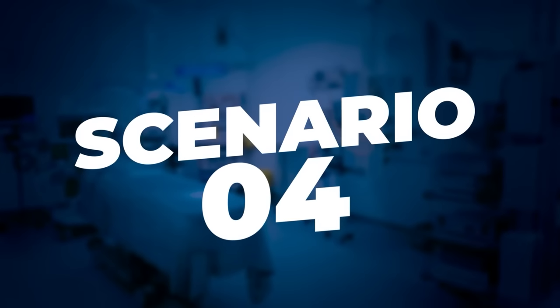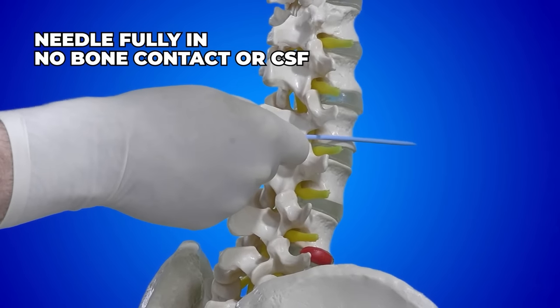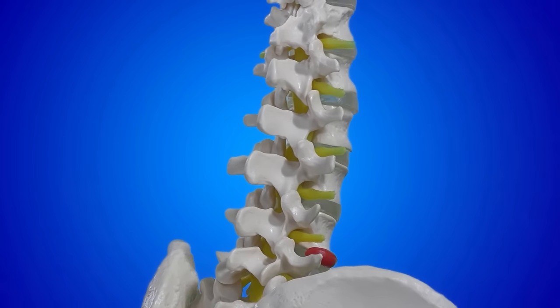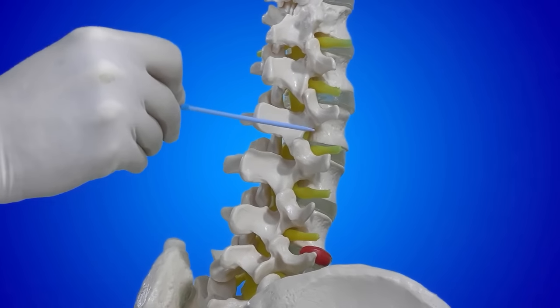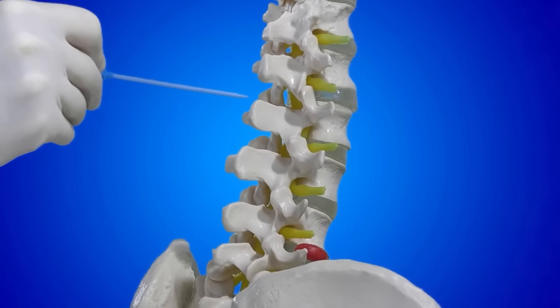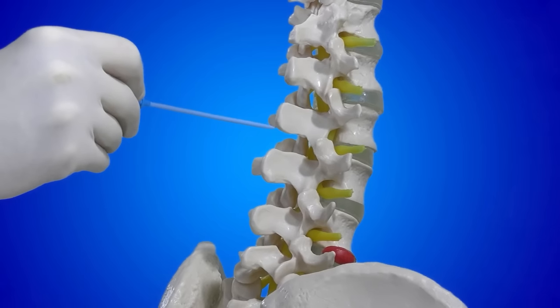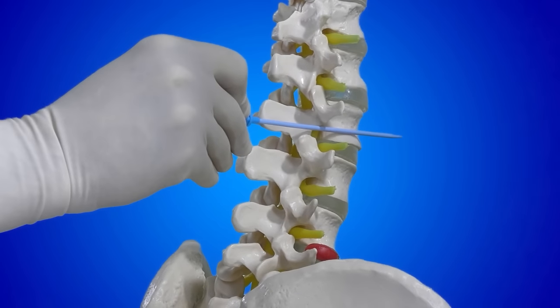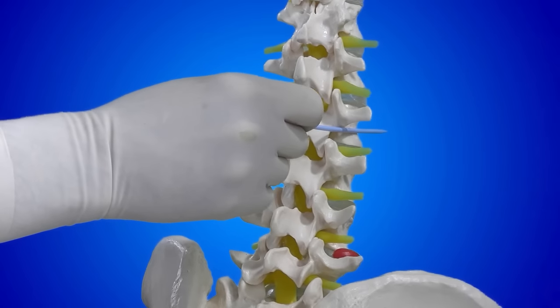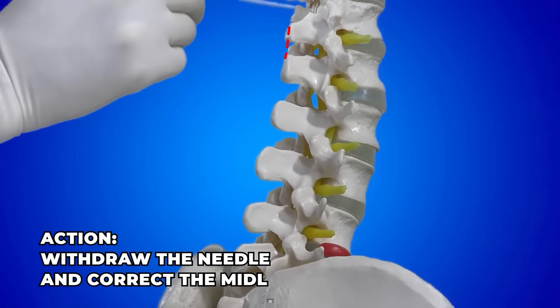Scenario number four: the needle enters all the way to the hub and you get no bone contact. Operators tend to think the needle is too short and request a longer one, whereas in fact they are paramedian without knowing it — they missed the midline and inserted the needle into the psoas muscle, edging toward the abdominal cavity. The course of action is to take the needle out completely and reassess for the midline.